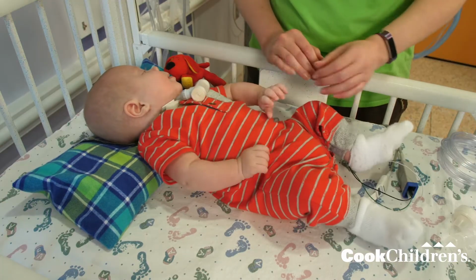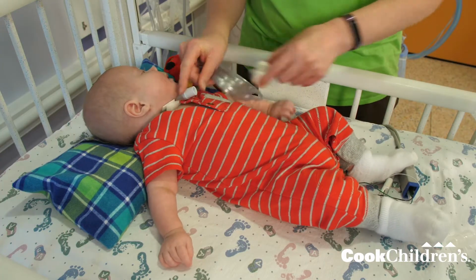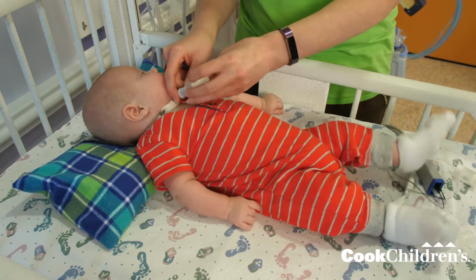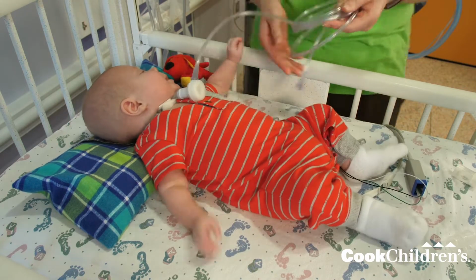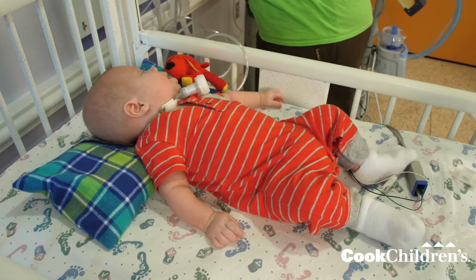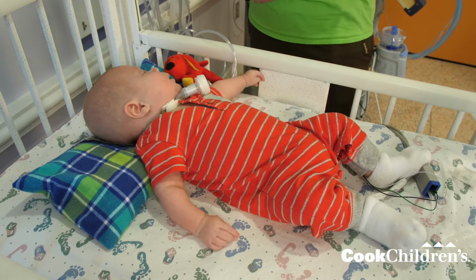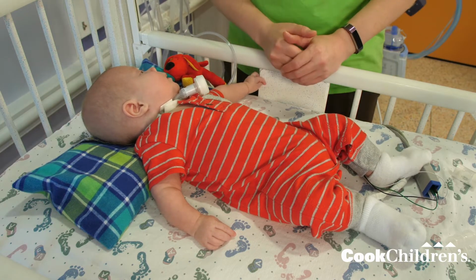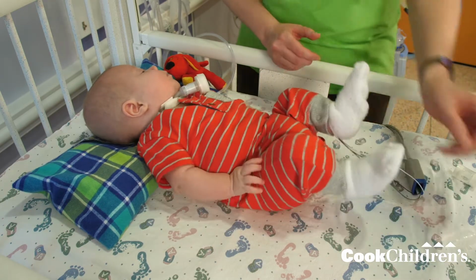The HME with oxygen connects to the end of the trach tube. Oxygen tubing is attached to the port on the side of the HME and to the oxygen source. The HME with oxygen can be used to give up to 2 liters of oxygen. Giving more than 2 liters of oxygen with an HME with oxygen can cause difficulty breathing.